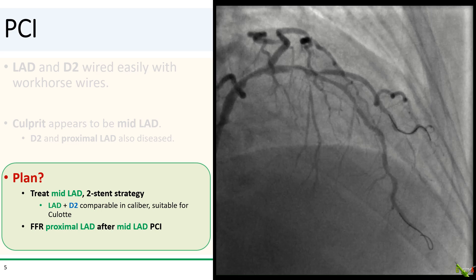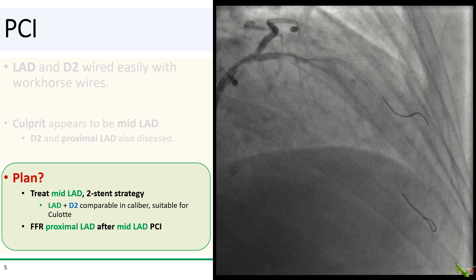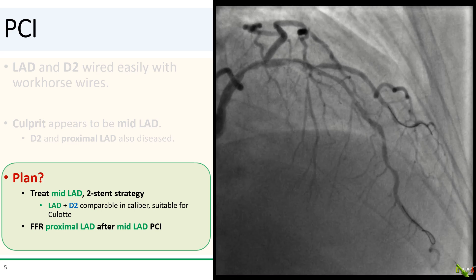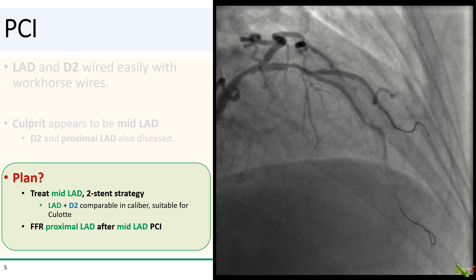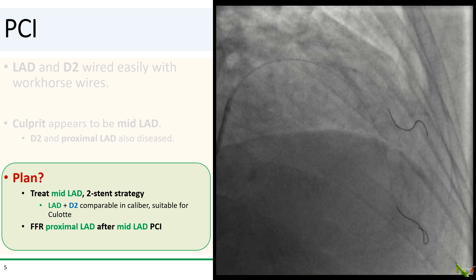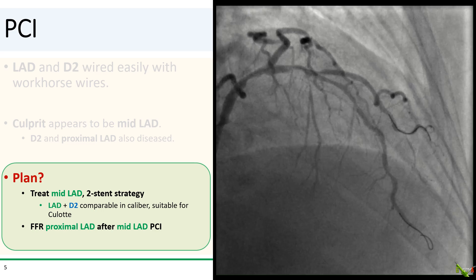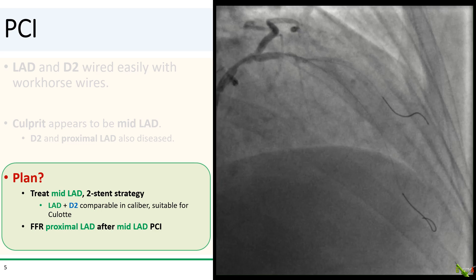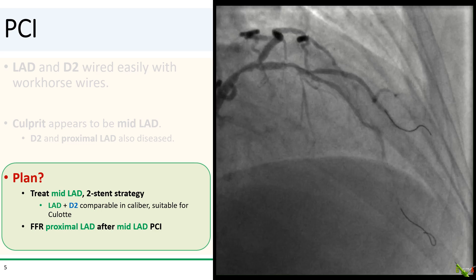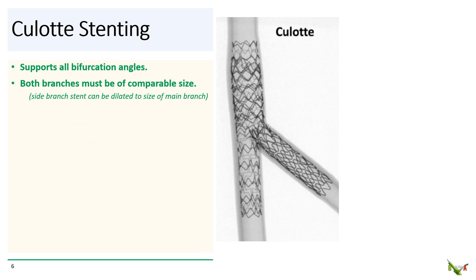All right, so here's the plan. We're going to treat the mid-LAD with a two-stent strategy. The LAD and D2 appeared comparable in size, so it seems suitable for culotte. And after stenting the mid-LAD, we're going to do FFR and decide if the proximal LAD also needed to be stented.